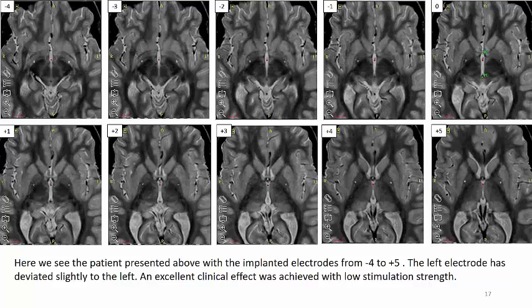Here we see the patient presented above with the implanted electrodes from 5 mm above the ACPC down to 4 mm below the ACPC plane. The left electrode has deviated slightly to the left, but an excellent clinical effect was achieved with low stimulation strength.